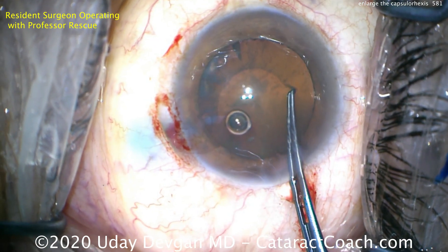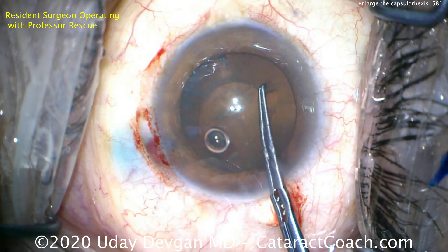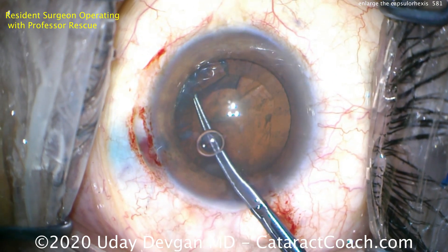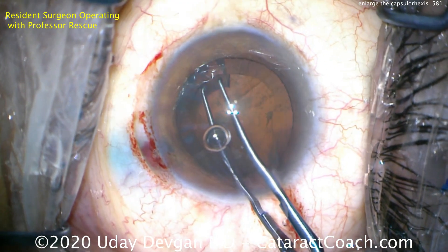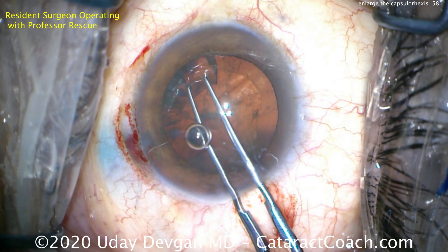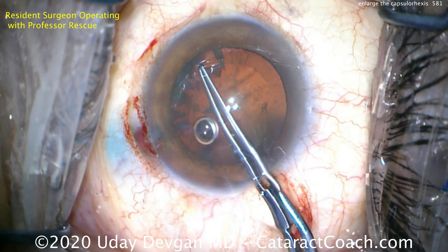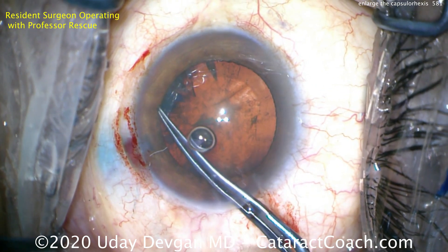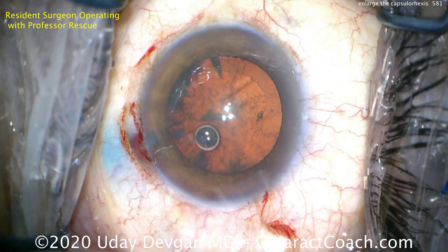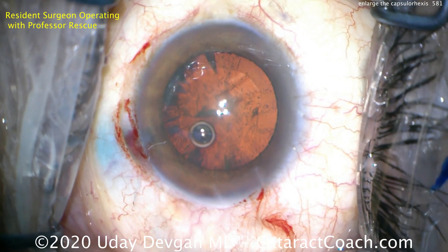Now, using the same capsulorrhexis forceps, we're going to tear off a crescent-shaped piece of anterior capsule. We grab that piece and start to tear, then continue to create the ideal opening — about five millimeters — and it's also going to be very well centered. Tearing that off and grabbing it again, finishing that capsular tear.